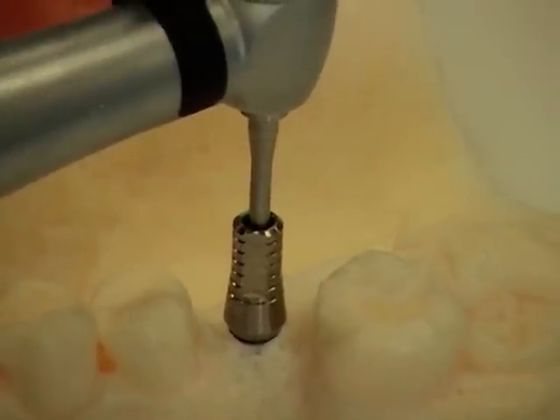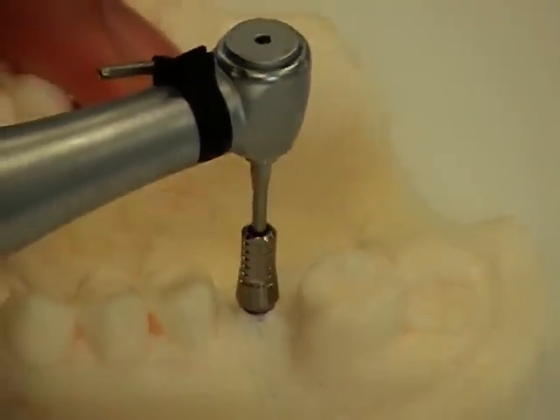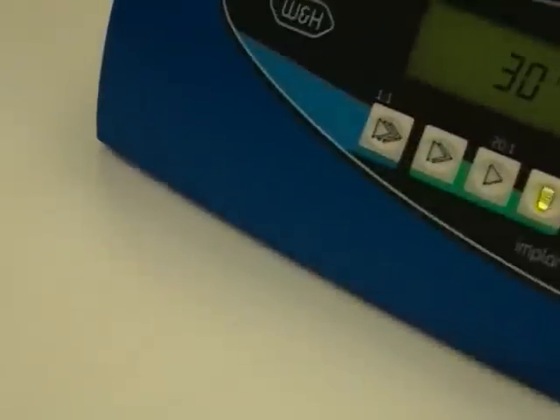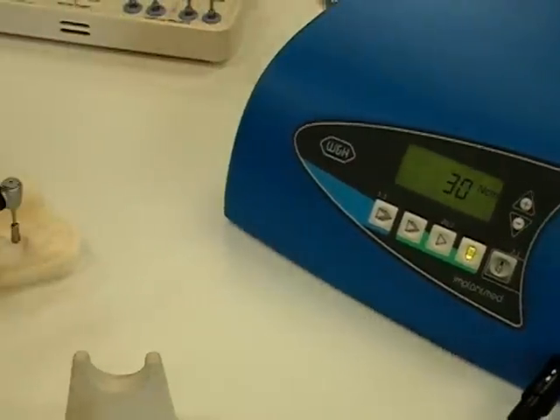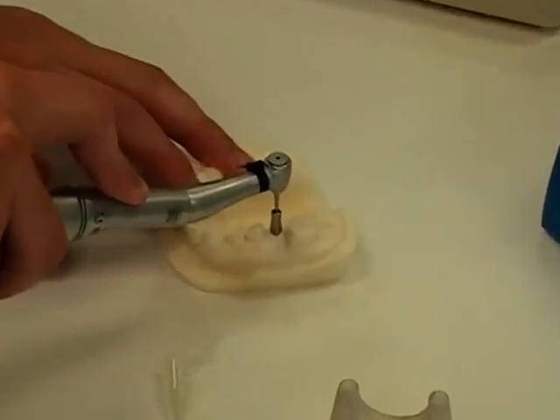The motor will turn very slowly, and very slowly insert the screw. When it reaches the 30-newton-centimeter torque that we've established, it will beep and shut off so that you do not over-torque the screw.